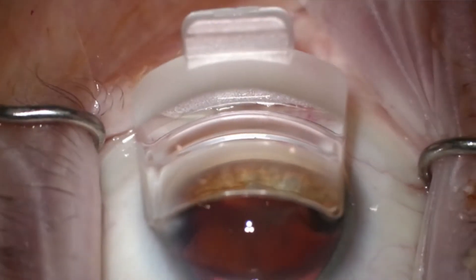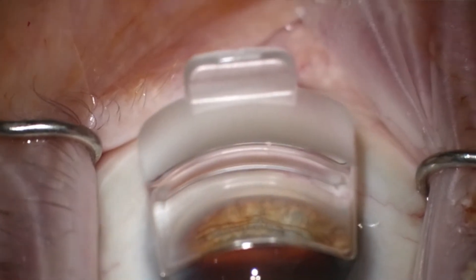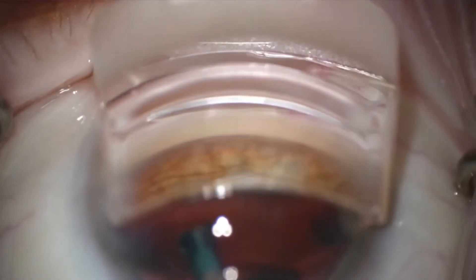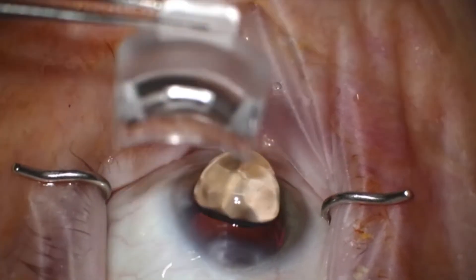One of the major benefits of the hands-free gonioprism is being able to be just that — hands-free. If you're like me and had prior experiences performing angle surgery where one hand is holding the lens and the other is holding the device, and you just wish you had an extra hand so you could give the hand holding the device some extra support — feeling like if you could just let go of one hand but without losing your view — well, that's what you can do with a hands-free gonioprism.